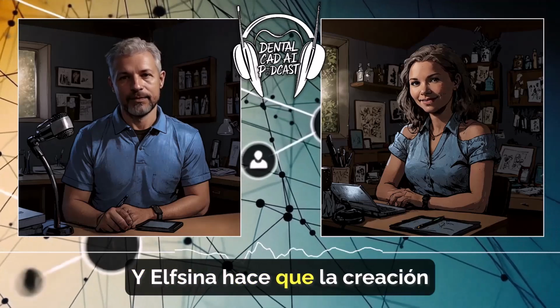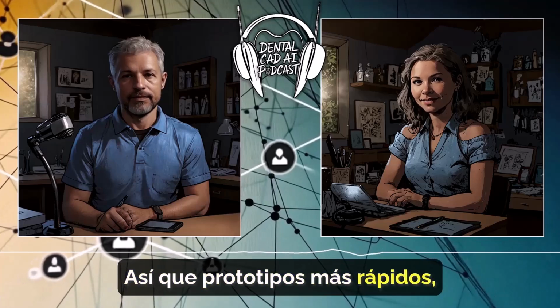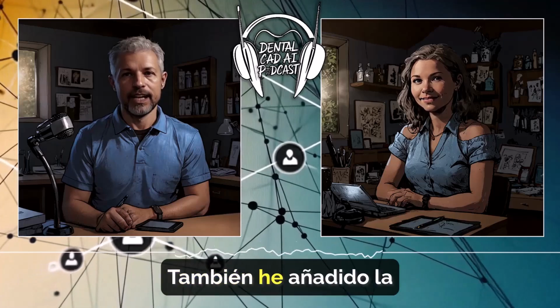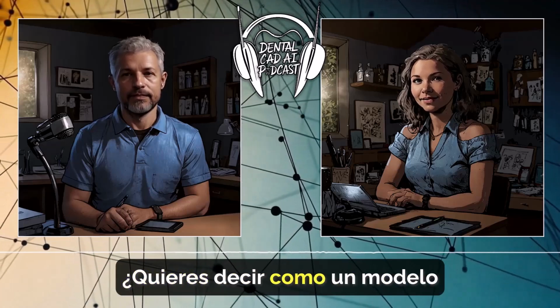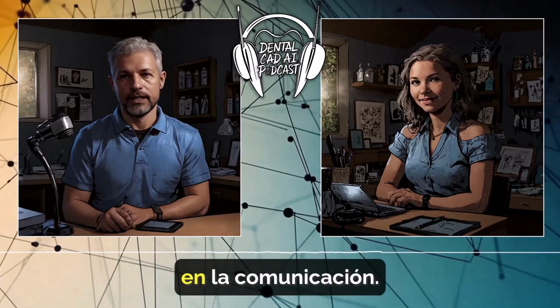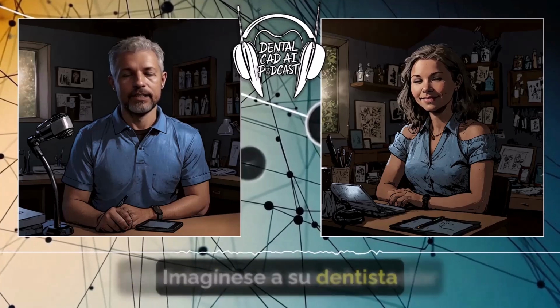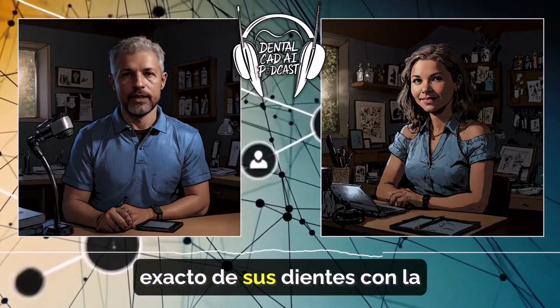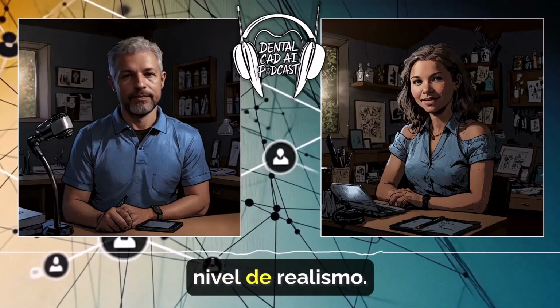Okay. And Elefsina makes creating these mock-ups way faster. So faster prototyping, faster results. What else? They've also added the ability to export colored models. Wait, colored models? You mean like a full color model of my teeth? Exactly. It's a huge leap forward in communication. Wow. I can see how that would be helpful. Yeah, imagine your dentist showing you a color-accurate model of your teeth with the proposed restoration. It definitely brings a whole new level of realism to it.